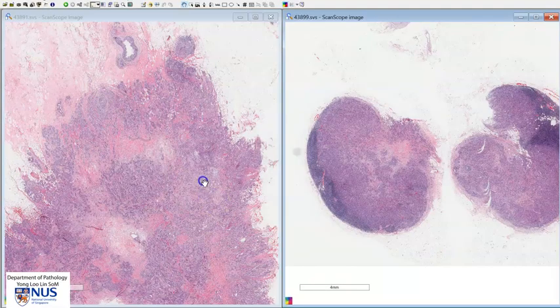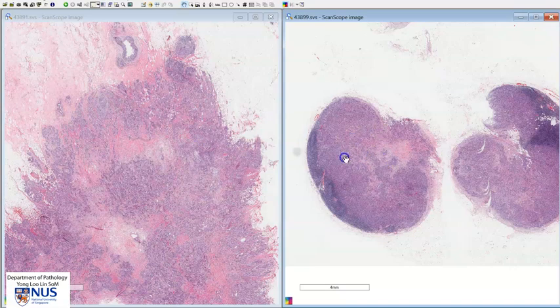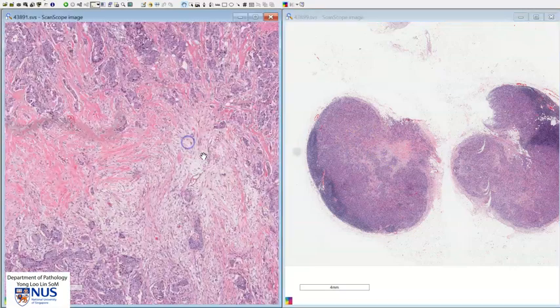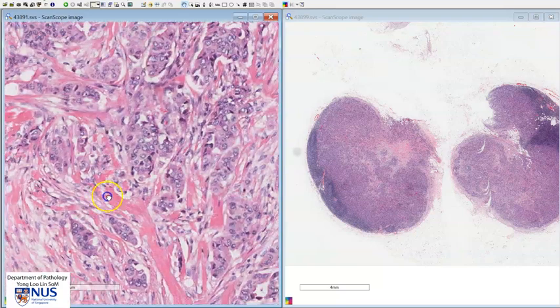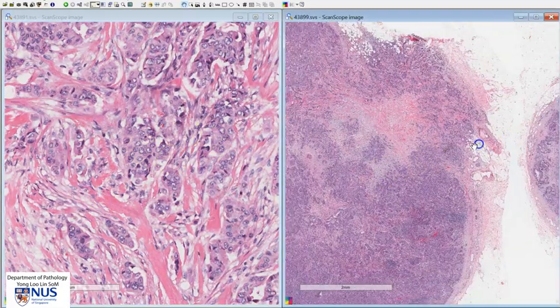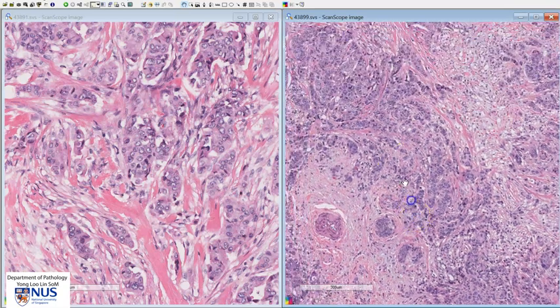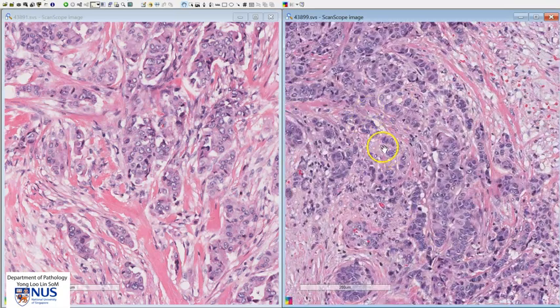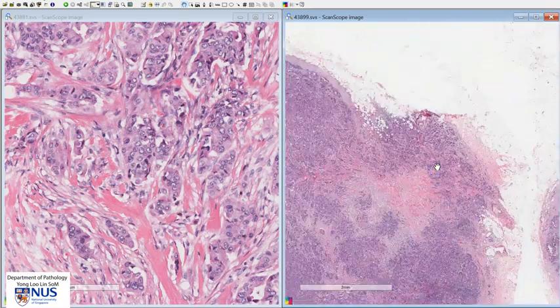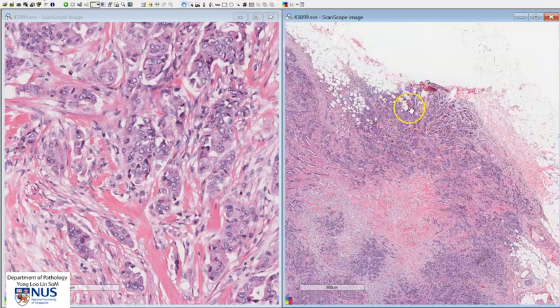In summary, this is an example of a case of invasive carcinoma of no special type, or invasive ductal carcinoma of the breast with axillary lymph node metastases. We can see that the primary carcinoma looks very similar to the metastatic deposits in the axillary lymph nodes. Also, in this particular node there is an area of extra nodal spread, which is an adverse prognostic factor. Thank you.